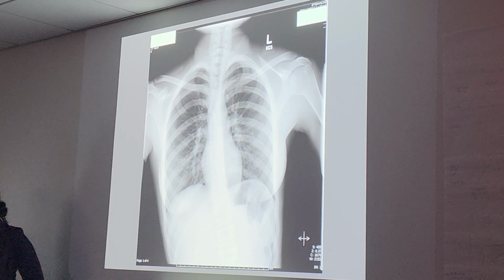The S value for this is 400. Is that going too deep? It's on point? Okay. 200 to 600, yes.